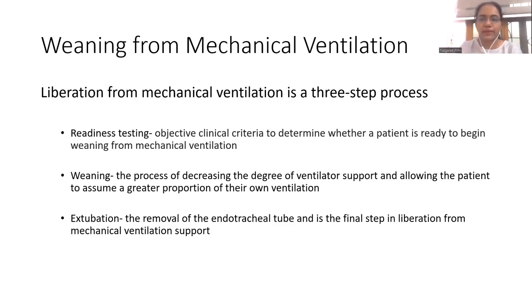How do we define weaning from mechanical ventilation? This is the liberation of a patient from mechanical ventilation, and it involves a 3-step process. First is the readiness testing, and then the weaning and extubation.